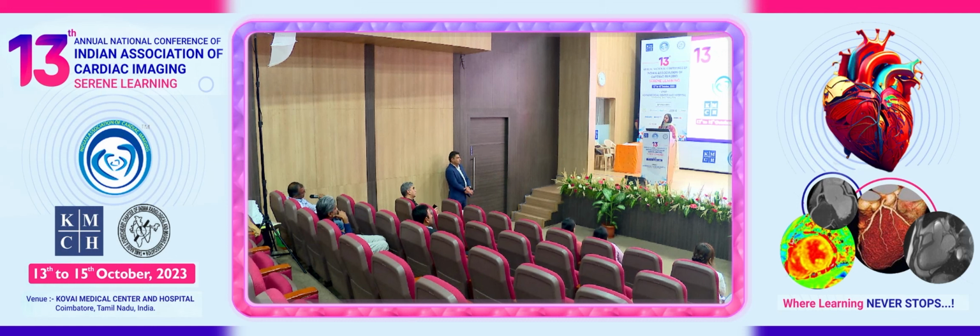If there is no lesion, then either it is technical or there is some ischemia that is perhaps at a microvascular level. Because what I worry about is, in an area where there is no stenosis, you've got a low FFR value suggesting ischemia. Now, if there was a 40% lesion, and again you had low FFR values, we are going to falsely call them as positive in that case.